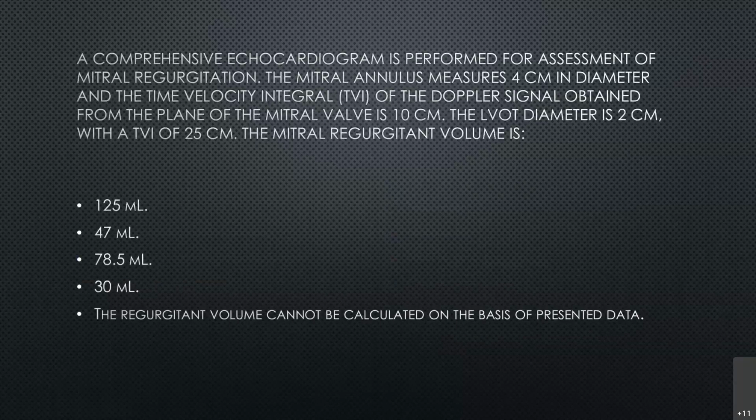A quick question. Yeah, because we get these patients with calcific mitral stenosis that also have diastolic dysfunction. Is it that we cannot use it at all, or is it for severe diastolic dysfunction? It's for severe diastolic dysfunction. And again, these patients are not easy, and I would recommend using other ways of doing it. There are 3 more ways how you can get mitral valve area, and you should use other ways, including continuity, which will be on this formula.